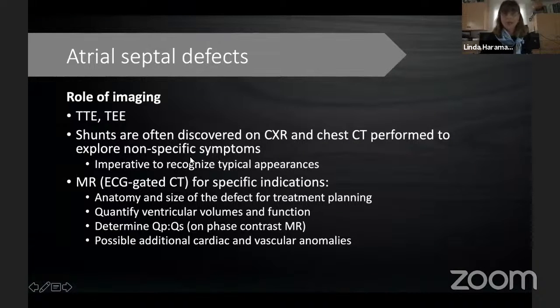The symptoms are unrelated, or in some cases, the symptoms are very non-specific, but they are related to the underlying shunt. And it's imperative to recognize these typical appearances when we see them, because even though they're typical, they're also difficult to recognize. And I'll show you some examples.